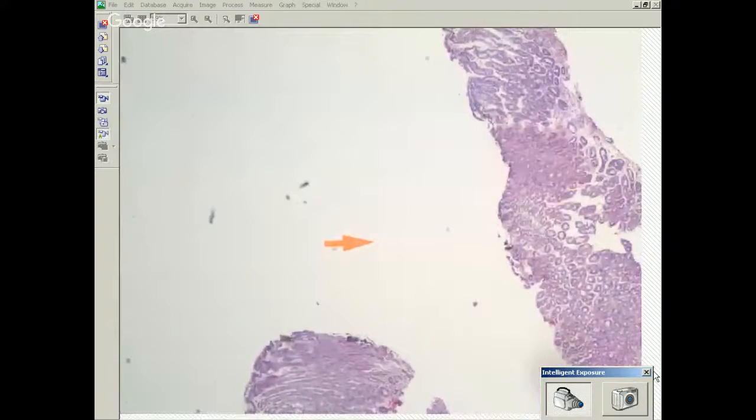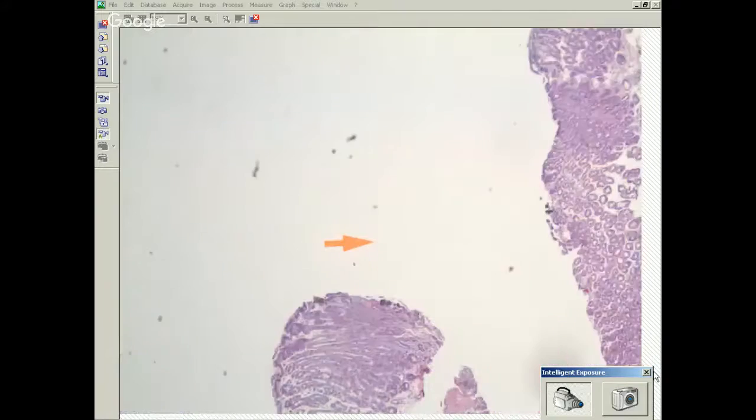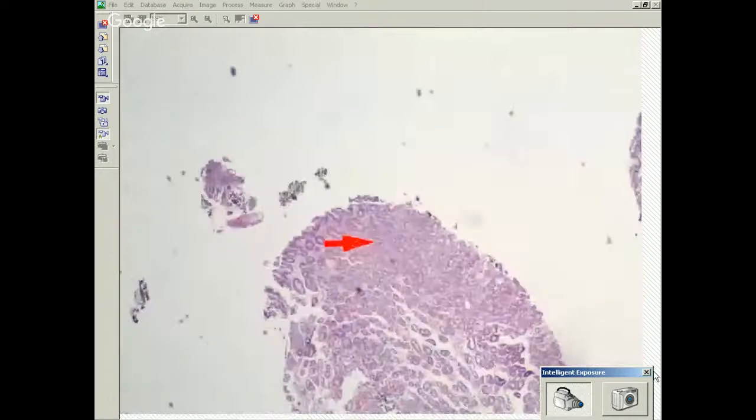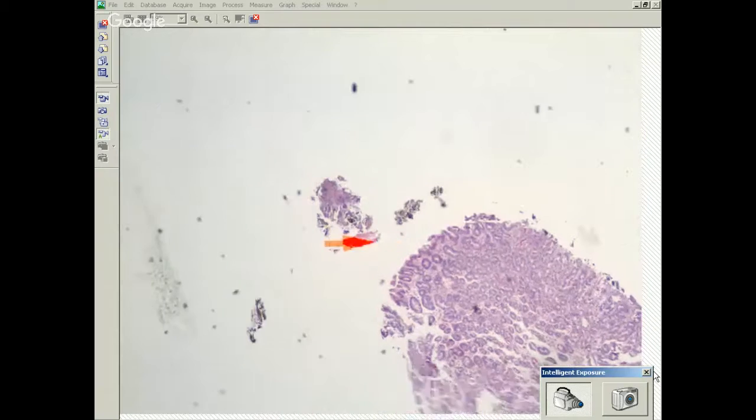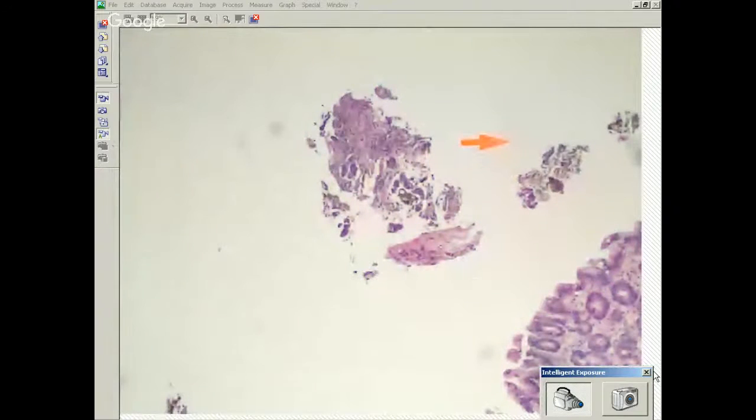What's notable about this? How does it look? It looks locally ulcerated in some of the areas. You can see some ulceration. There is not much inflammation, but what is significant is the acellular material which is there. It's refractile brown, clumpy material. It looks like it's probably something like iron pill. Yeah, this is pretty much diagnostic for iron pill gastritis.